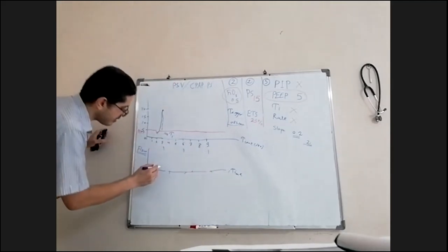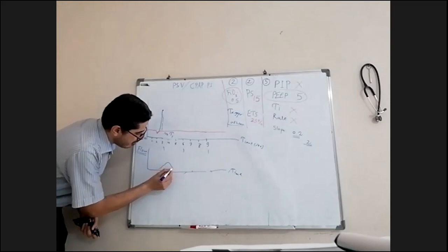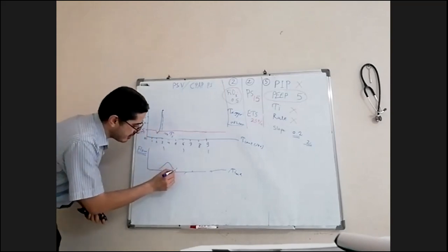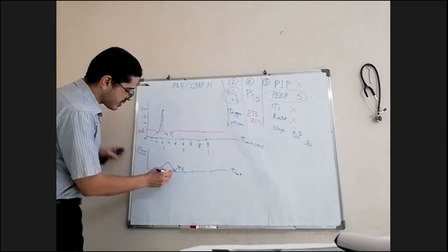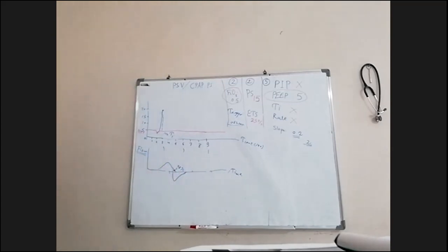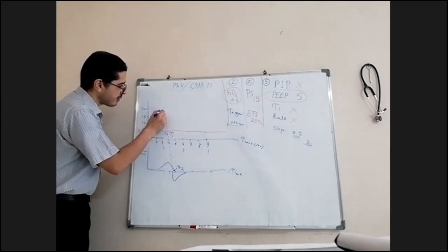we will see the patient having flow, and at this point, when 25% is left. 25% of the flow is left here. This is the ETS. 25%. The patient will go to expiration. Will go to the expiratory flow. The patient will go to expiration. So this point will be at the same level here when the patient goes down.